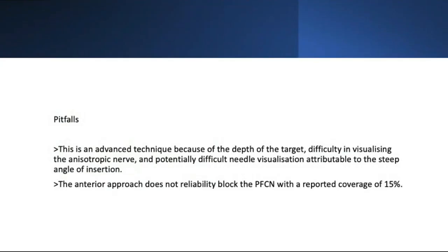So maybe if you want to learn, you can ask Dr. Amir, because of the depth of the target and how difficult it is to visualize the nerve. The anterior approach does not reliably block the PFCN, the posterior femoral cutaneous nerve, with a reported coverage of about 15%.